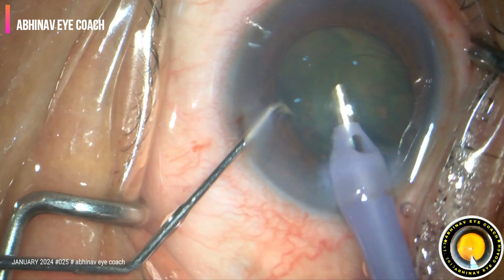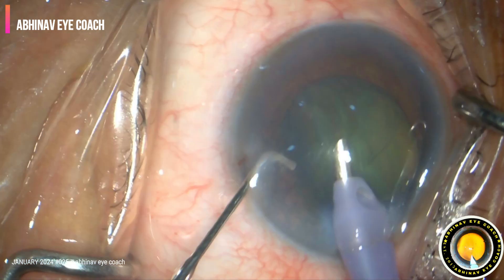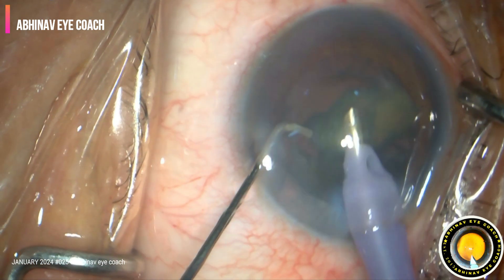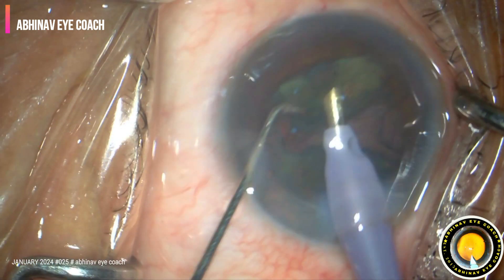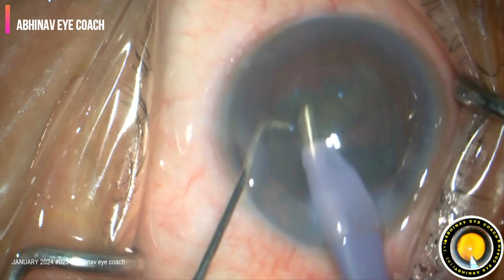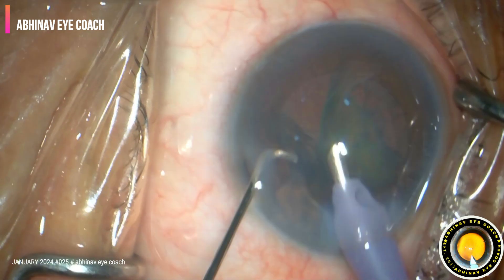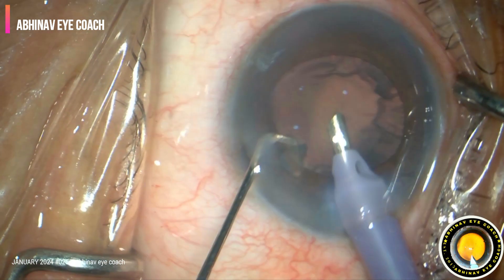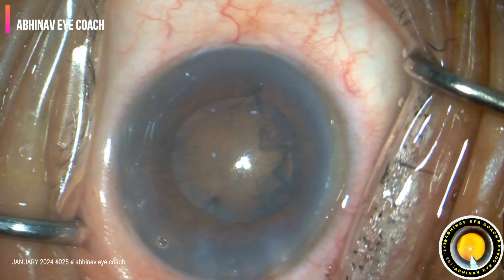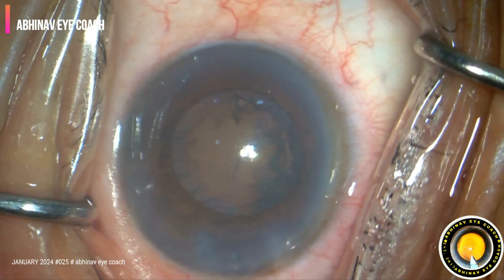Just be patient in such cases. Never use too much phaco — you should be easy on the phaco pedal, and be in foot pedal position two always. Keep the chopper in a safe position at all times; the tip of the chopper should not break the posterior capsule. Always keep yourself in foot pedal two or irrigation. If you are not used to it, just keep the continuous irrigation settings on in your phaco machine.